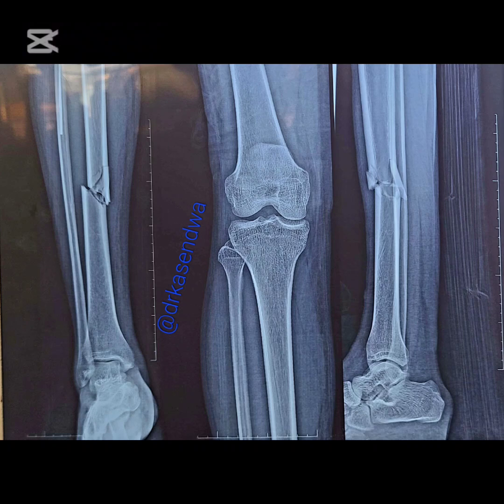So it is mid tibia because when you divide the shaft into thirds, you try to approximate that fracture line, and it is within the mid third. Then someone may ask themselves the reason as to why we included the knee and the ankle joints.